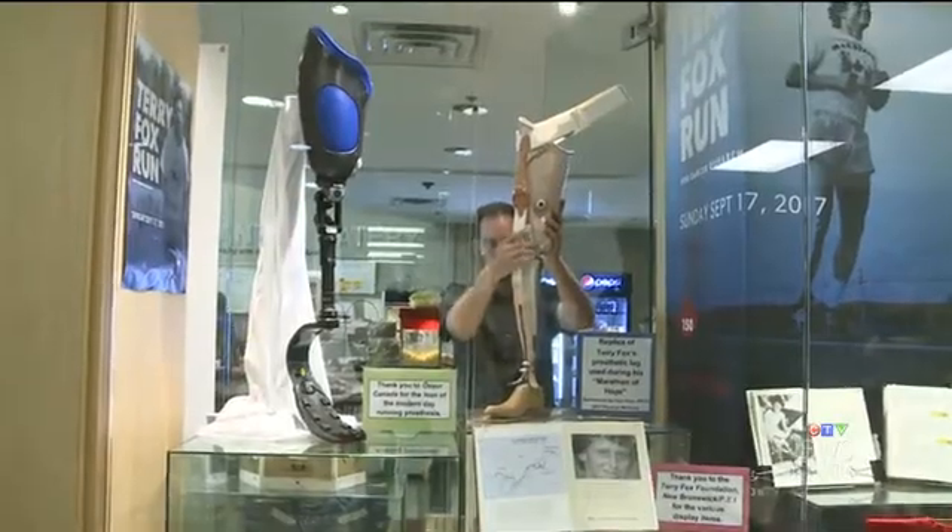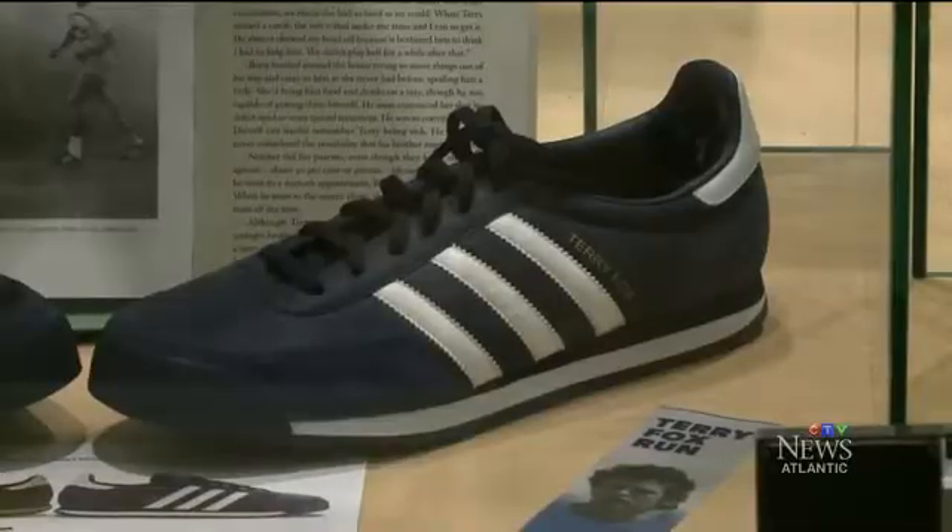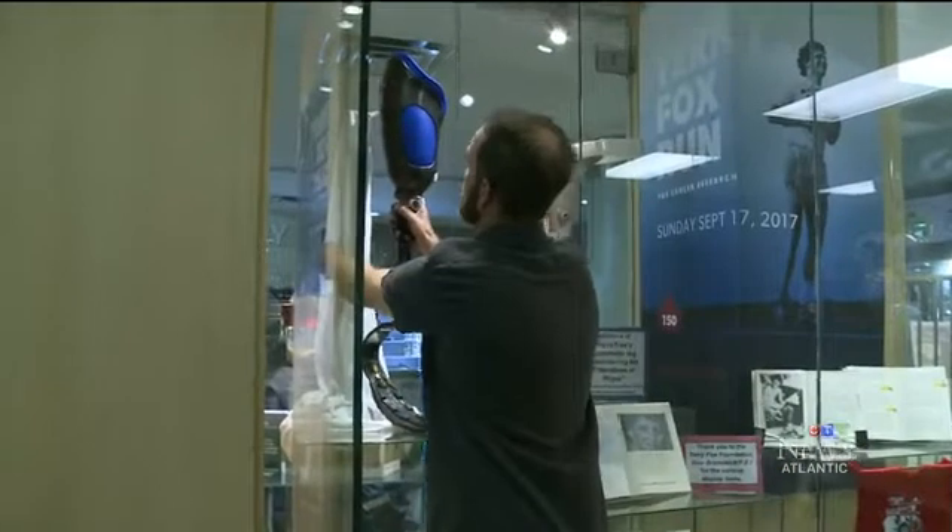It's something that had touched him when he was a kid. He brought in newspaper clippings he had saved in his scrapbook, because he knew this was going to be something important. The Queen Elizabeth Hospital decided to feature the prosthetic in a display dedicated to Fox, and a company donated a modern running leg for comparison.